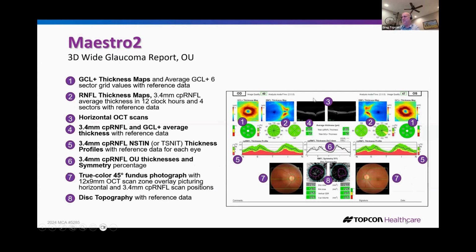And there are two sets of data, instant graphs, one per eye. The reason we don't mix them is because sometimes one eye or the other may be outside the normative range, and you really can't blend images on top of each other as one is outside the so-called reference range. That's actually pretty common, and we'll go over those ranges in a second.